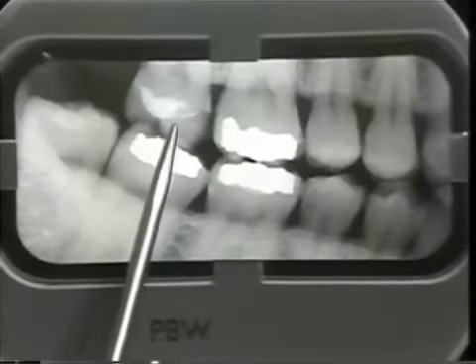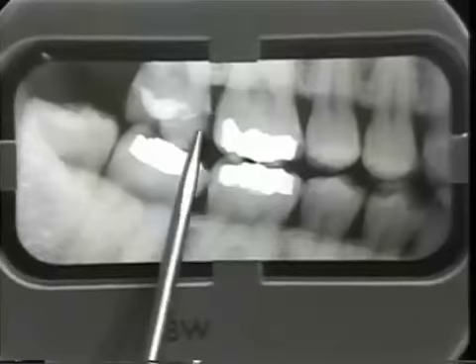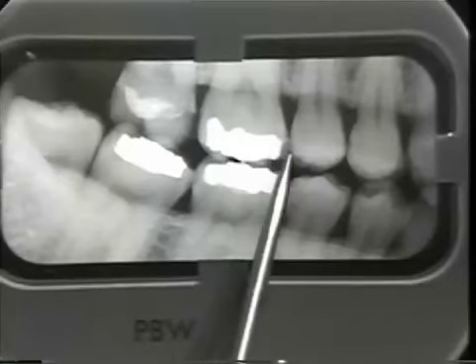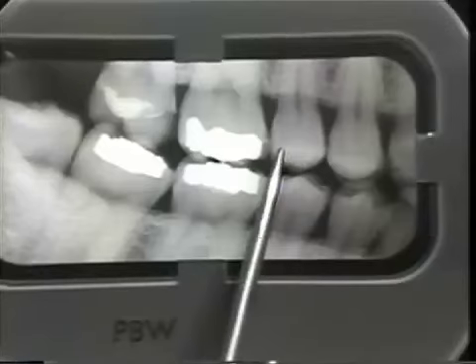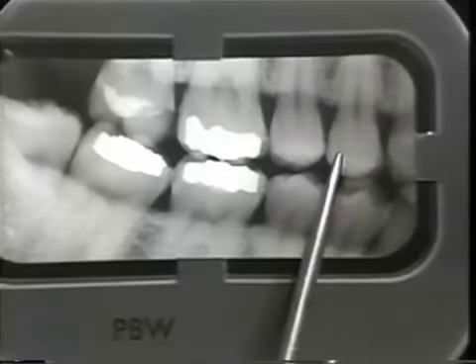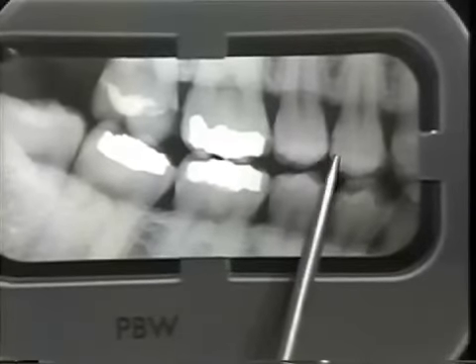And we will have the patient make a record as we progress on this 9A, 9B. Tooth number 3, we can see a small mesial and distal carious lesion. If we continue, we'll see 4-1 and a very small 4-2. Number 5-2 is quite evident, but the patient informs us this carious lesion has been present in this condition for at least 5 years. So whether we do this restoration or not depends on the history of the case.